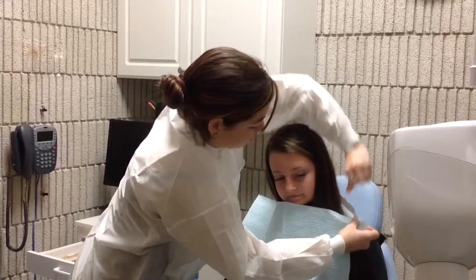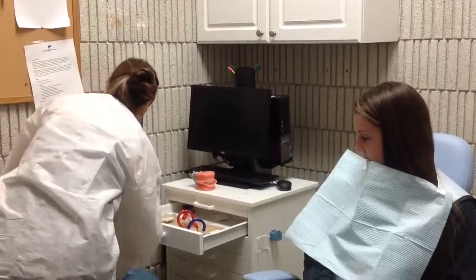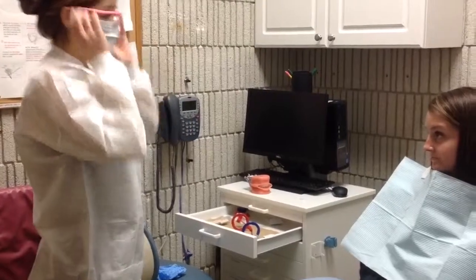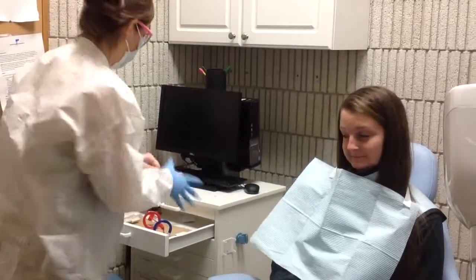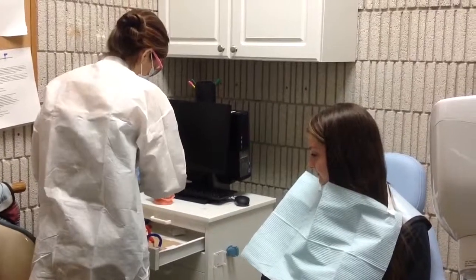All right. Now I just need to put on my mask to protect us from each other's germs, and my glasses in case you sneeze, and then my gloves because we don't want to put my dirty hands in your mouth. No way. All right. So the first one we're going to take is your front teeth.